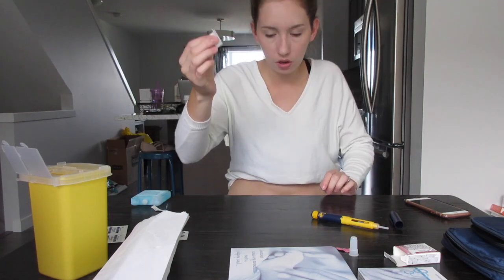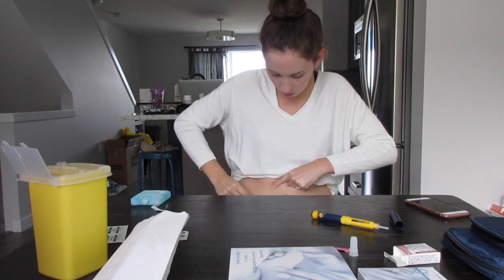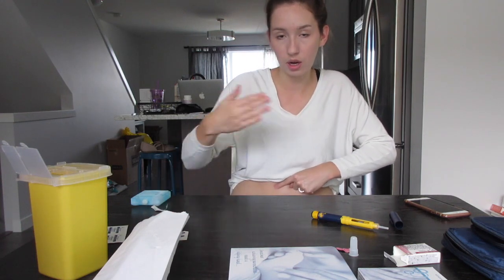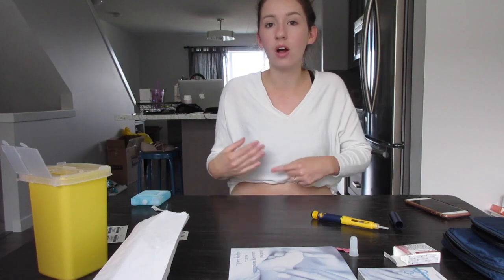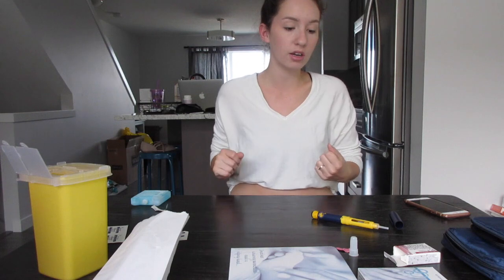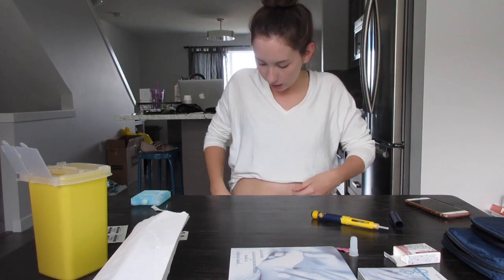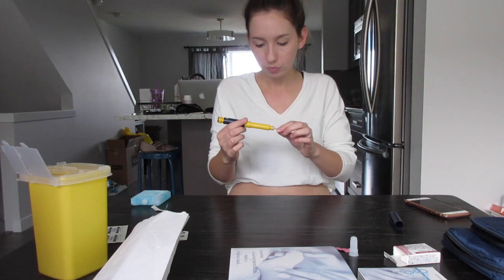All right, so with your alcohol swab, you're going to clean the area. I always like to clean more space just in case I find a better spot, then I won't have to wipe it again. It's a good idea to let the alcohol on your skin dry completely before you do the injection. That way the alcohol doesn't get inside, which could possibly sting more. And this already doesn't feel the best, so why make it hurt more, right?